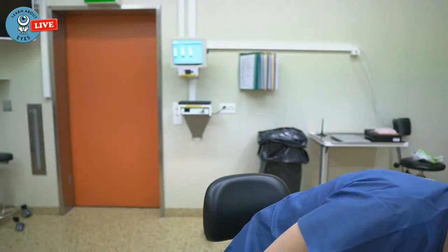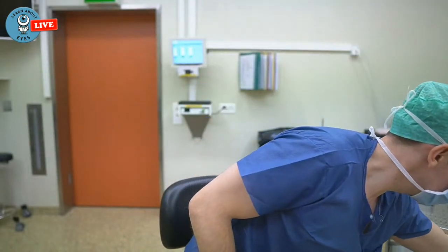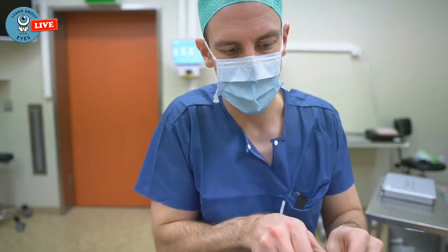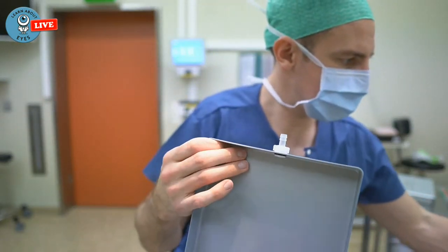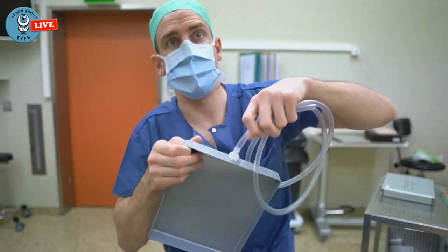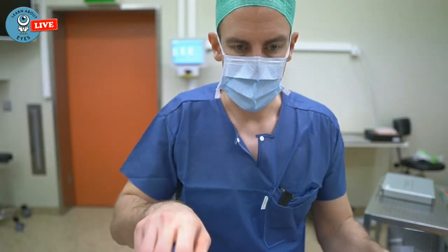because this head is quite expensive, they have a basic head that is just a piece of plexiglass with a hole in it. Works fine, but you create a crazy amount of water on the floor, so you kind of have to clean up afterwards, which sucks. So here you can just connect this and then put in the tube. There we go. And then you put this into a bag or something. There we go.